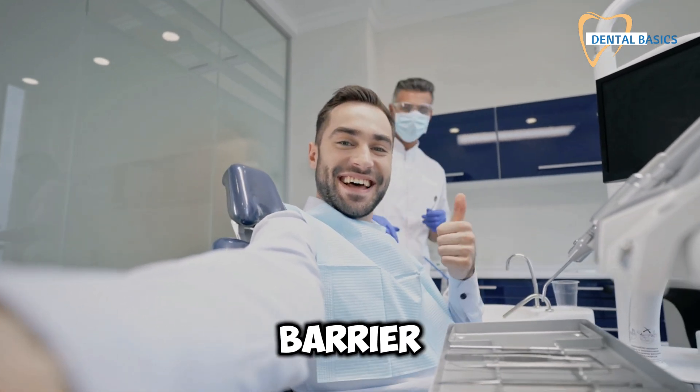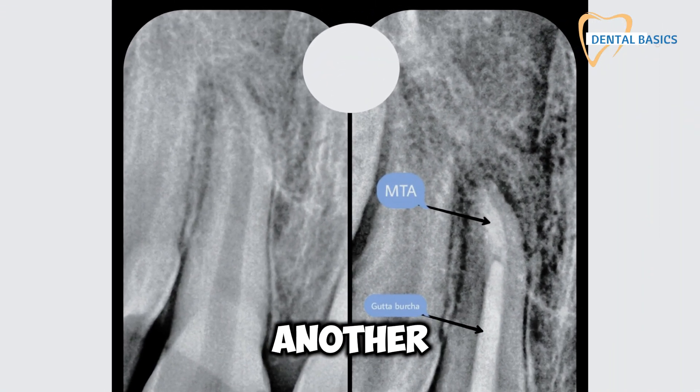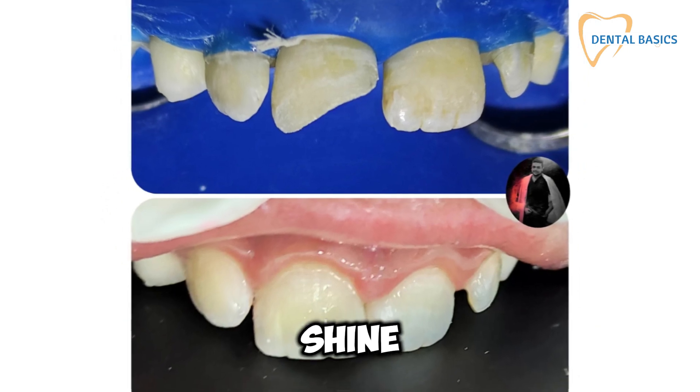Once the calcified barrier is solid, it's time for the final restoration. Whether you're using gutta percha or another endodontic material, ensure the canal is fully sealed and the tooth is ready to function and shine again.